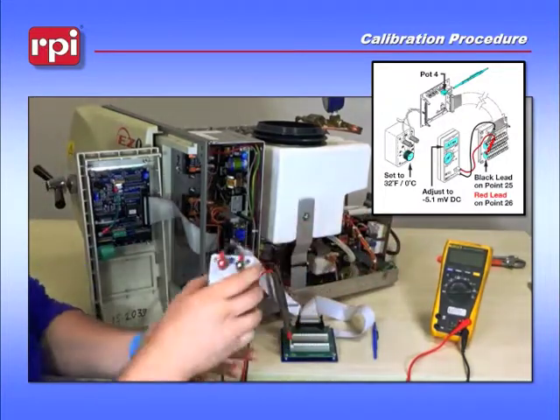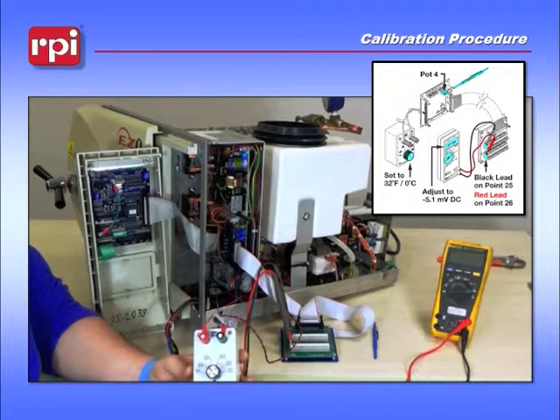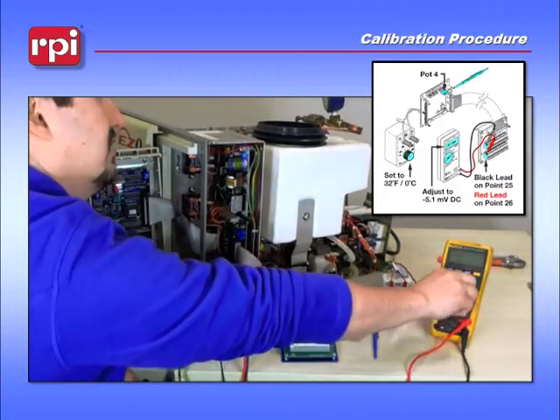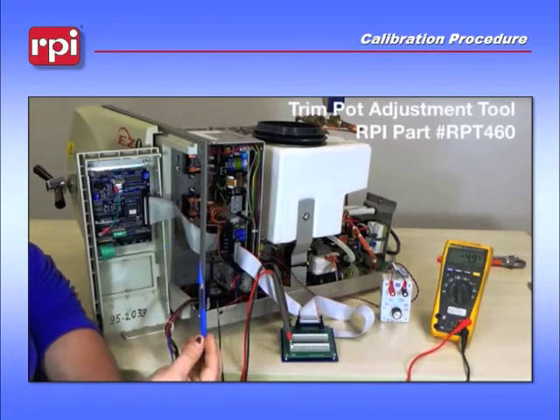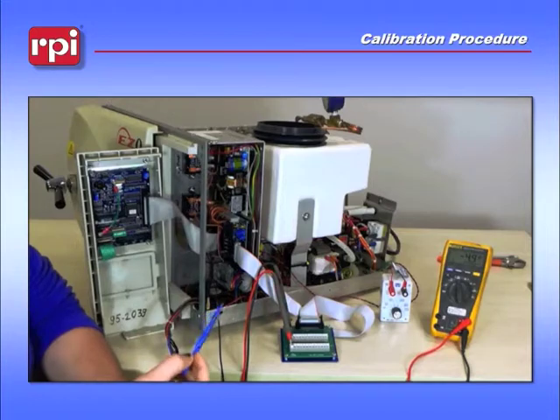Make sure that your TUT-114, your PT-100 simulator, is set to 32 degrees Fahrenheit or zero degrees C. Next, turn your multimeter to the millivolt DC scale. Then grab your RPT-460, your trim pot tool, to adjust pot 4 on the Adjunct 3 board.